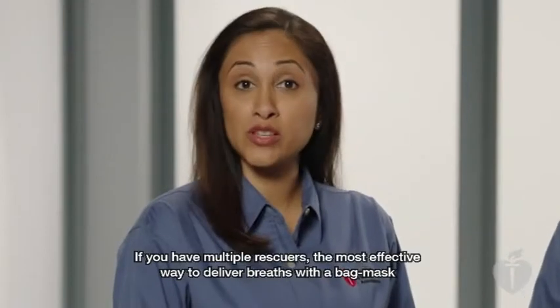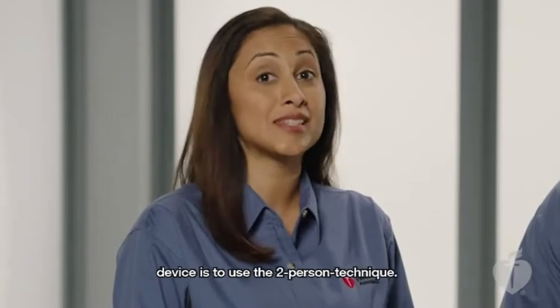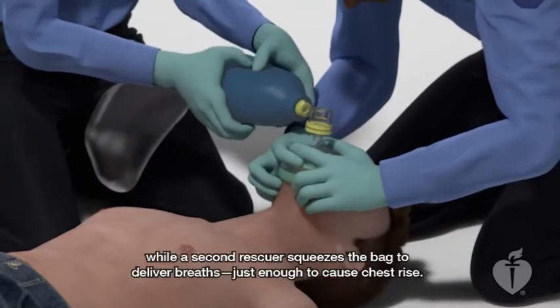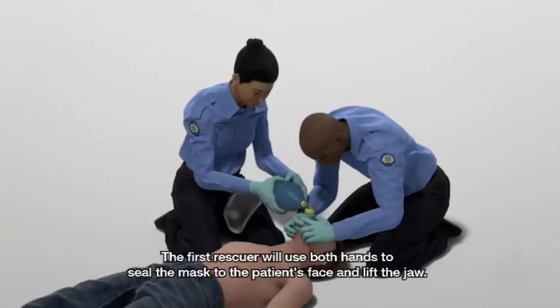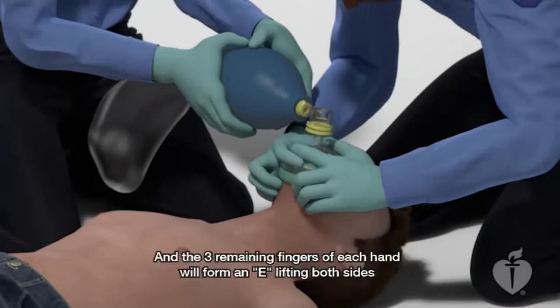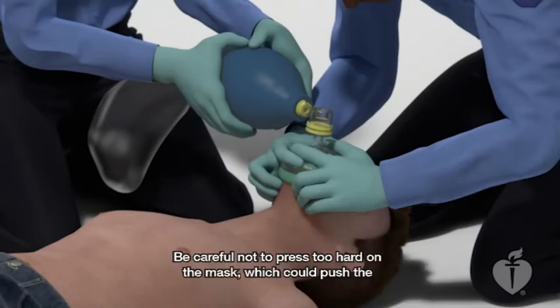If you have multiple rescuers, the most effective way to deliver breaths with a bag mask device is to use the 2-person technique. One rescuer focuses on keeping the airway open and securing the mask, while a second rescuer squeezes the bag to deliver breaths, just enough to cause chest rise. The first rescuer will use both hands to seal the mask to the patient's face and lift the jaw. The thumbs and index fingers of both hands each form a C to seal the mask against the face. And the 3 remaining fingers of each hand will form an E, lifting both sides of the jaw into the mask. Be careful not to press too hard on the mask, which could push the patient's jaw down and block the airway.